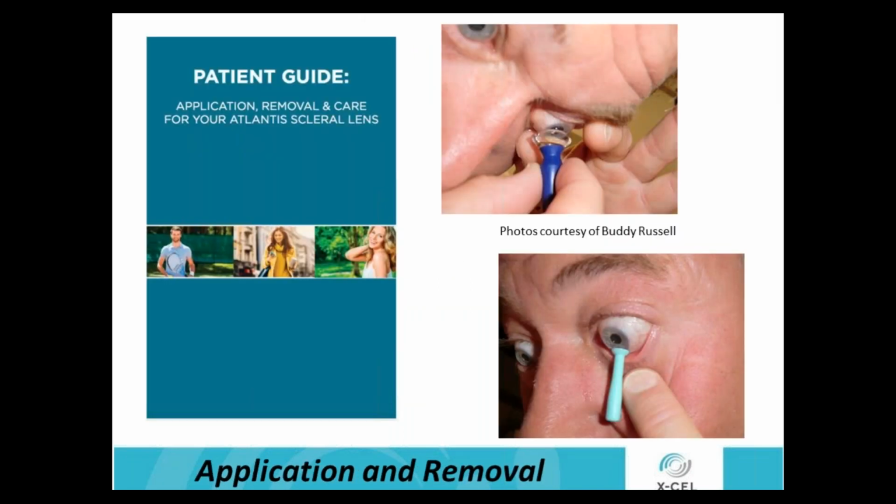As we look at this and we talk about the patient and how they handle the lens and the insertion and removal process, I always go back to this: it's great, we can teach them everything we can in the office, and we have great resources online that they can use. But once they leave that office, what control do we have over that patient? So knowing that they are applying and removing that lens properly is very, very important. So it's repetition, repetition, repetition.